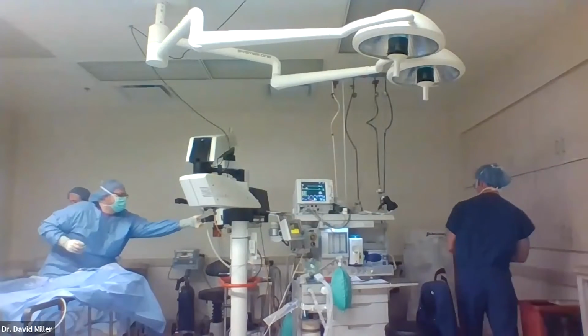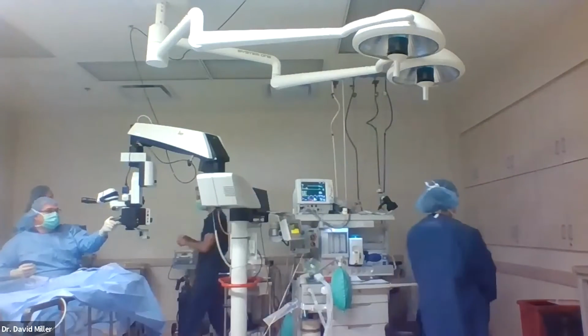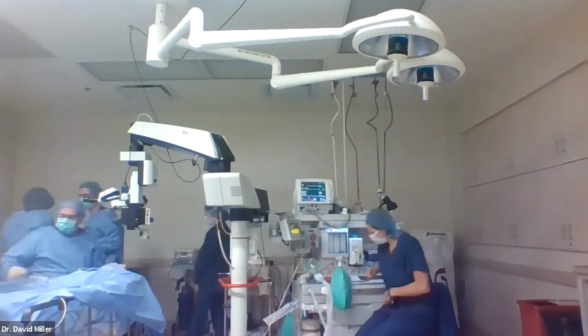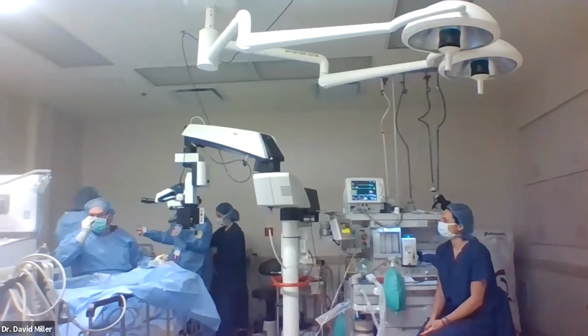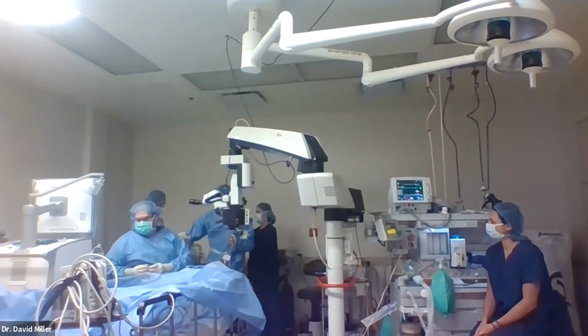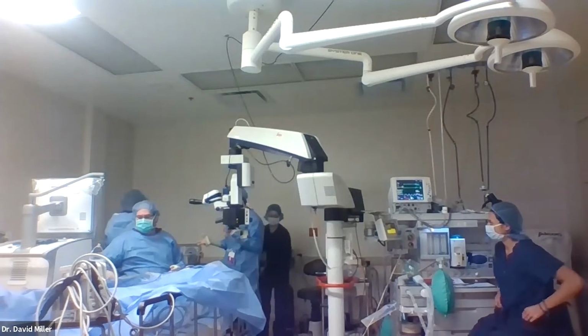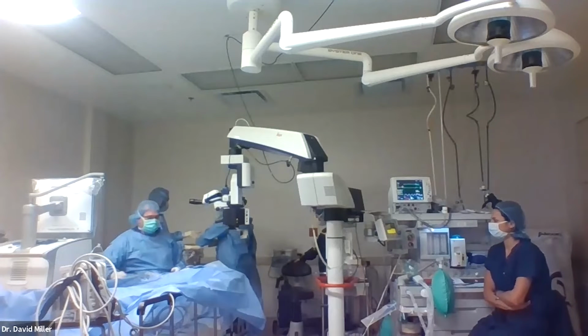So ideally, these cases run about 30 to 45 minutes for a straightforward rhegmatogenous retinal detachment repair. Certainly, cases can be longer: giant retinal tears, multiple tears, vitreous hemorrhage to clear out first. If you have to take the lens out of the eye, all those things can add time and complexity.